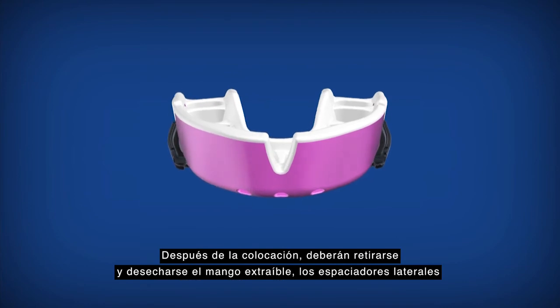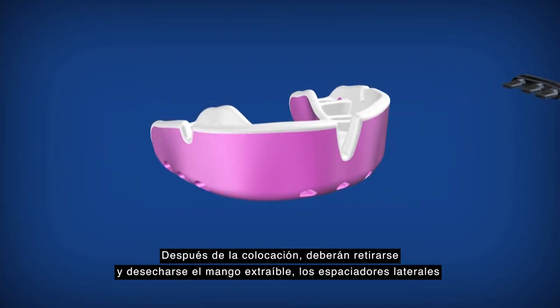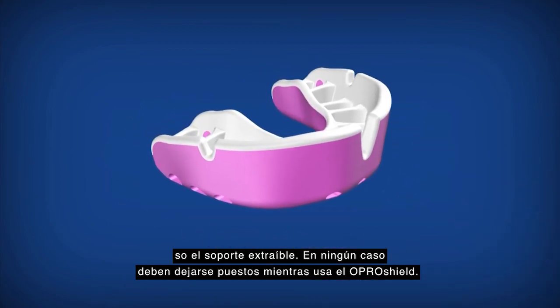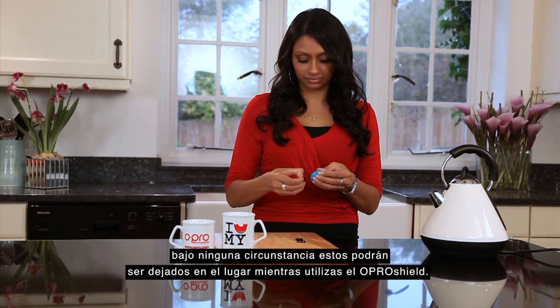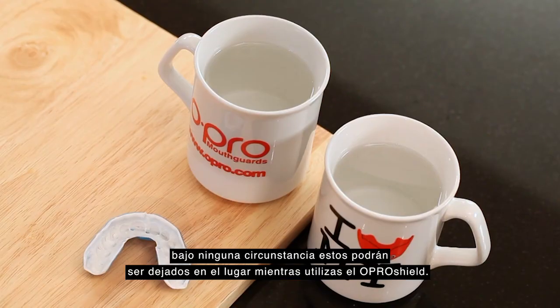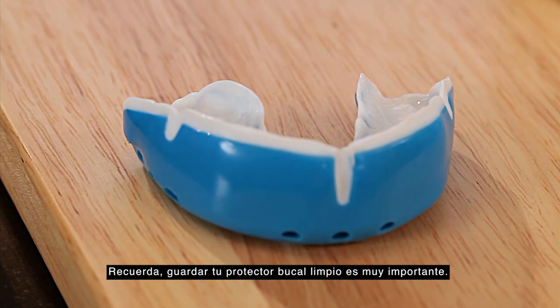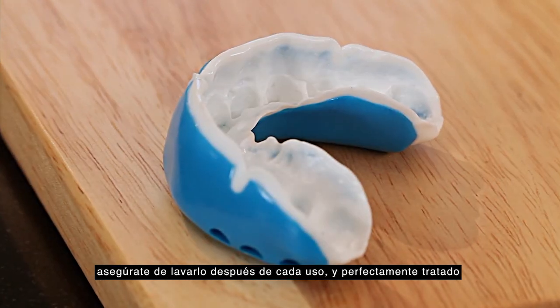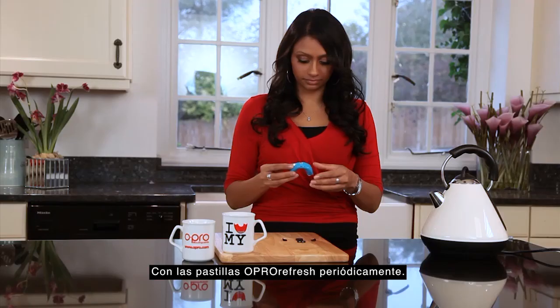After fitting, the removable handle, side spaces, or removable cradle should be removed and thrown away. Under no circumstances should they be left in place while wearing the OproShield. Remember, keeping your mouthguard clean is important. Be sure to wash it after every use, and ideally treat with OproRefresh tablets on a regular basis.